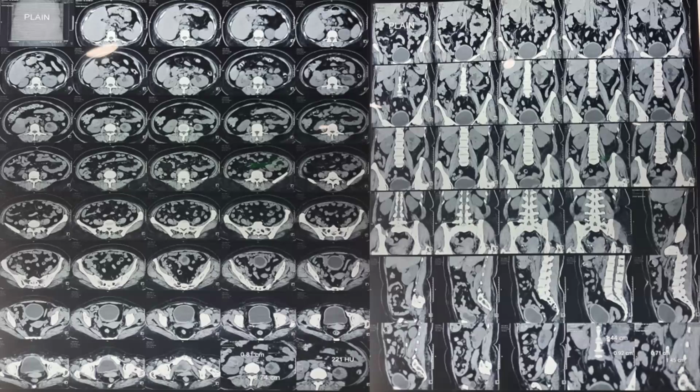So Mahendra, what will you do now? Suggest what will you do now. You have this CT scan with 2 films. Then what will be your next step? Would you like to start the management based on these CT scan, or you will do something else?